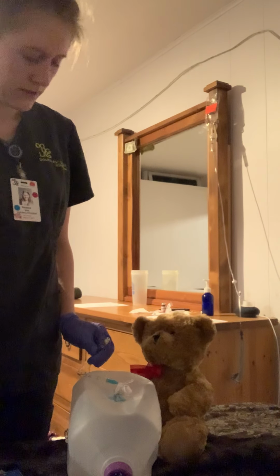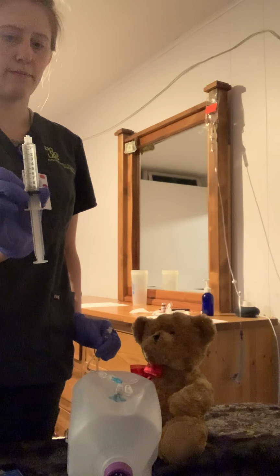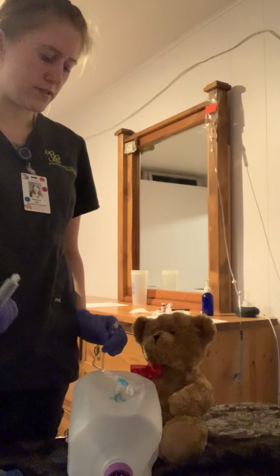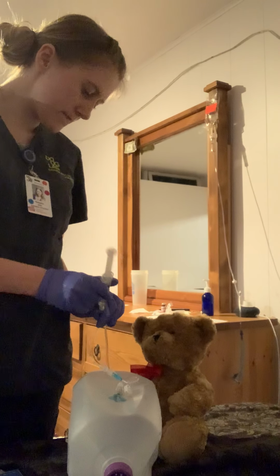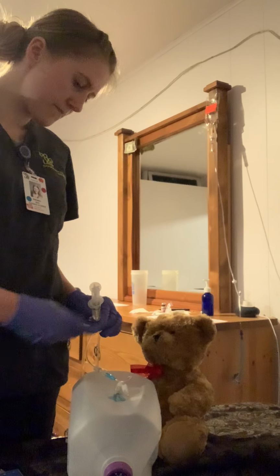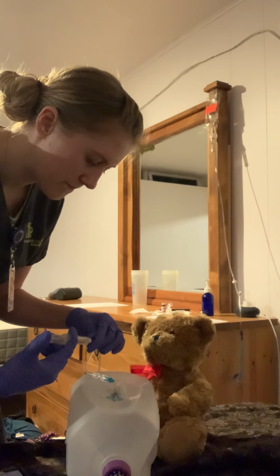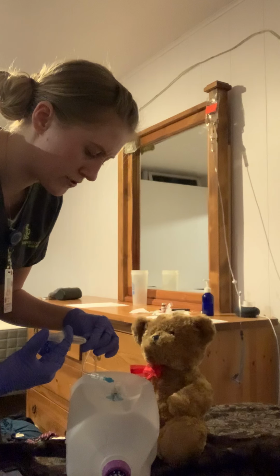Okay, keeping it clamped. I want to let it dry. I've got my solution here. It's already been primed. And then this is just checking for patency, and then also, again, it's incompatible, so I'm just clearing the line. Twist that on. Again, just making sure I don't touch the plunger. So this, I'm just, again, making sure it's patent, clearing the line of the solution right now.